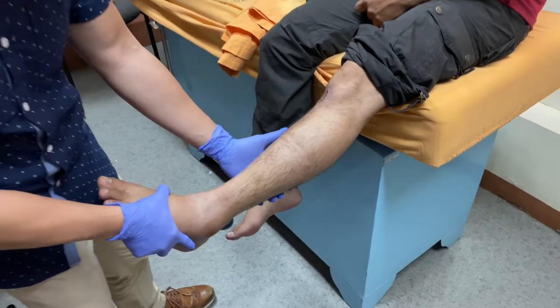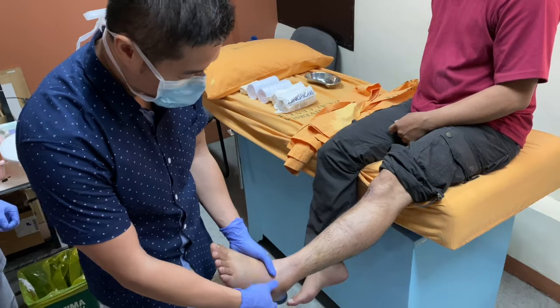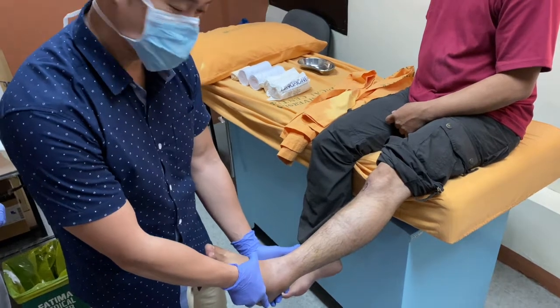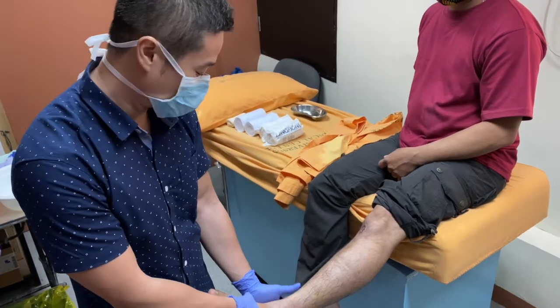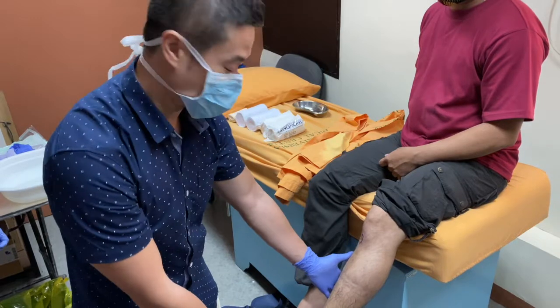We will be placing a circular cast on the left leg of our patient. He has a distal fibular fracture. After a week of applying a splint, we noted that there is decreased swelling, so we will now convert it to a complete circular cast for added immobilization and formal protection.